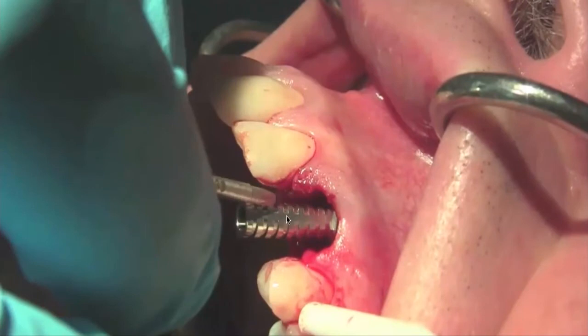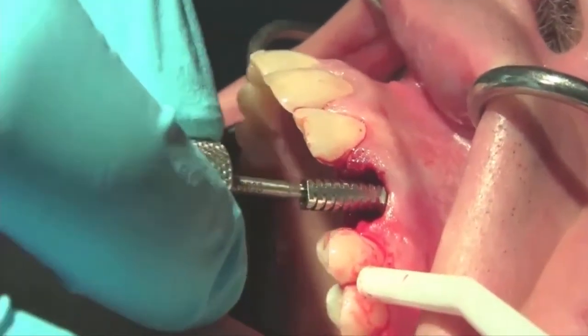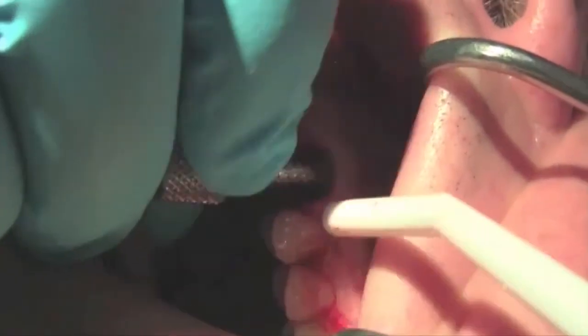In most systems, we create a little indentation or mark with a burr. With this system, you don't need to do that because you have indentations prefabricated in the abutment, and all you have to do is mark the specific spot where you want to cut the abutment for the interocclusal distance. So we proceed to remove it.